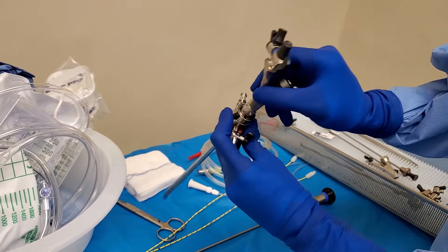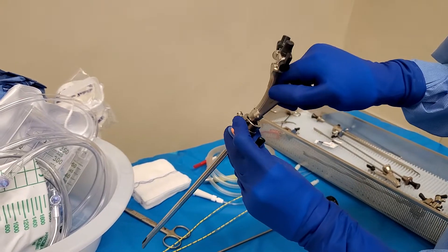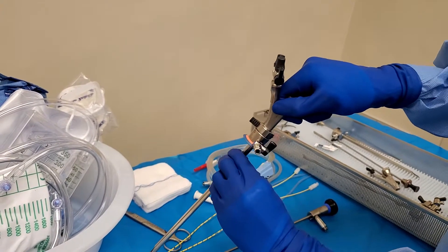That's a bit aggressive. There you go. And close — and it doesn't move.